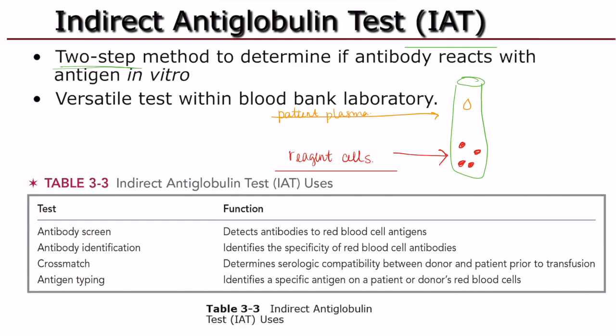And this, we're going to incubate it, add enhancement media, and give that the opportunity to attach if there are any antibodies present. We really don't want antibodies present, so we want a negative reaction. But in order for you to learn what's happening, I'm going to show you that there are antibodies in there. But we would prefer negative, no antibodies present, okay? So we're giving that time to attach.